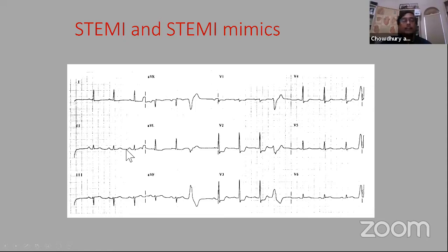What you can do to confirm this, I forgot to bring this. I had one where there was a little bit of inferior change, a 92-year-old, day before yesterday, 2 o'clock in the morning, and another EP guy was on call. We have a system called deactivation, meaning the EP guy deactivates, writes a note, collects the money for the consultation, and tells us to do routine cath in the morning. So there is a financial incentive also, right? But he recognized that there was minimal ST segment change in the inferior leads, so he told them to do leads V7, V8, V9. And then we saw the posterior ST elevation. So that is another thing you can do.